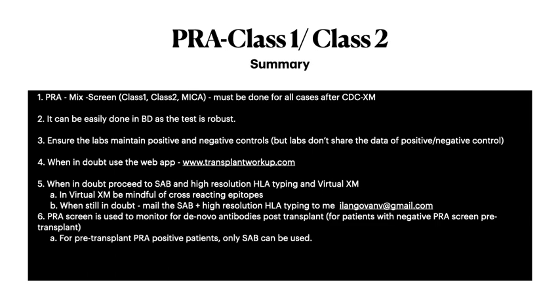So when in doubt, proceed to SAB and high resolution HLA. This is what I've done for the previous case. In virtual cross matches, we have to be mindful of cross-reacting epitopes. I'll be talking about cross-reacting epitopes later on. When still in doubt, you can mail the SAB and the HLA to my email ID, it's ilangovanv@gmail.com.